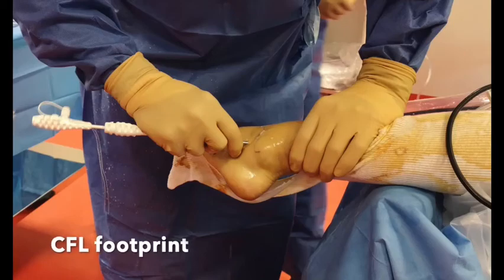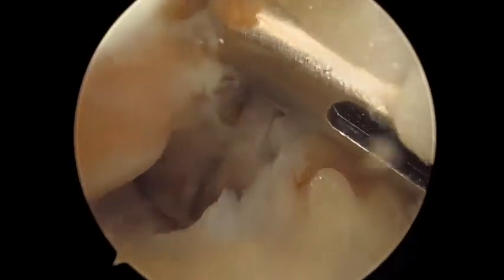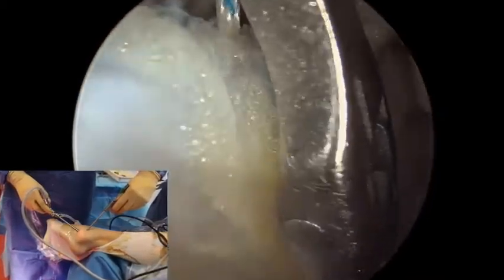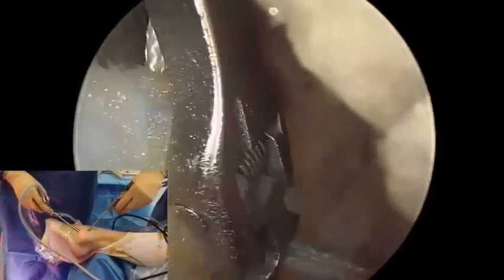The first anchor is placed in the CFL footprint through the endoscopic lateral portal. The arthroscope is then moved to this portal and sutures are passed through the CFL and the inferior extensor retinaculum.